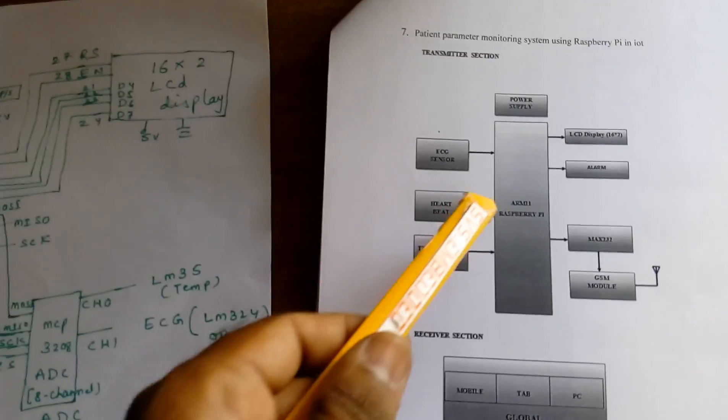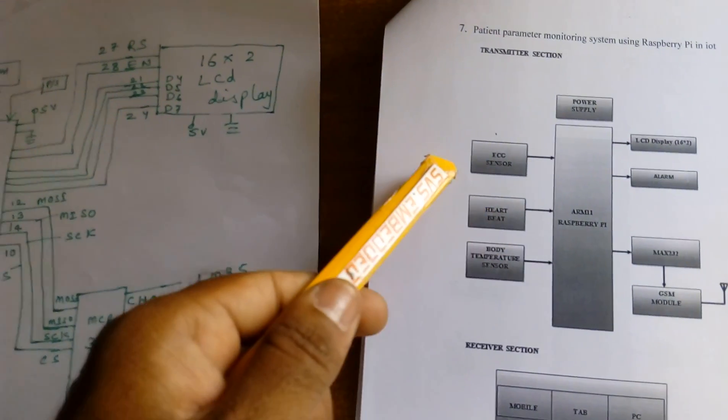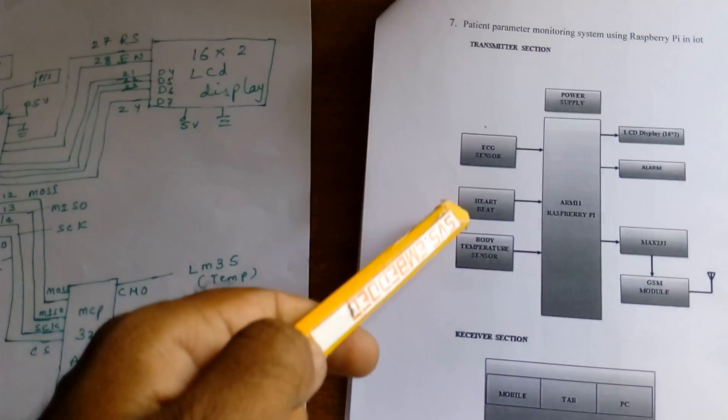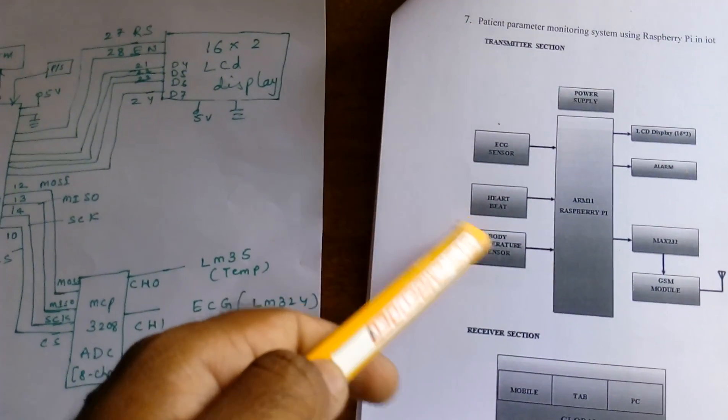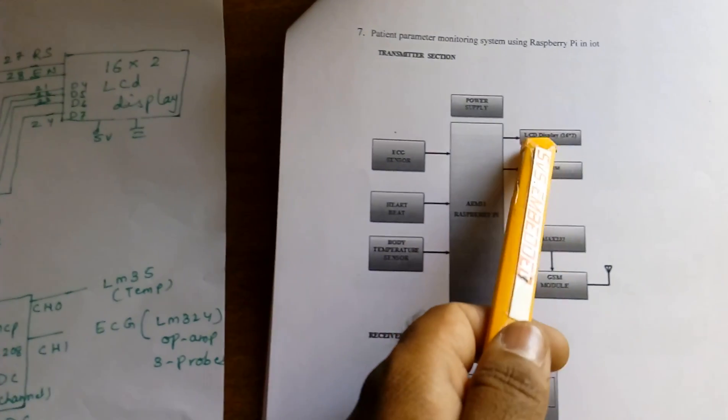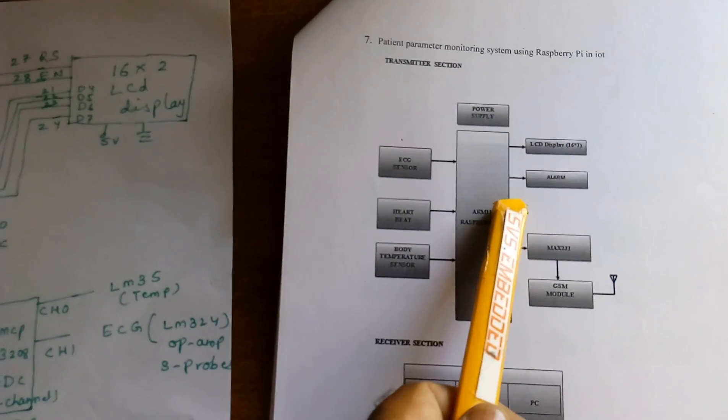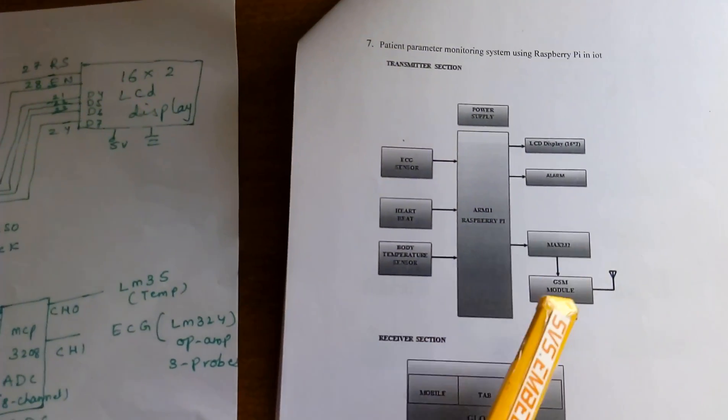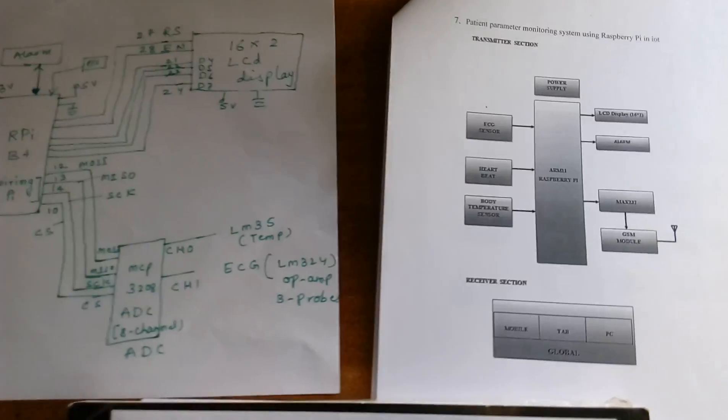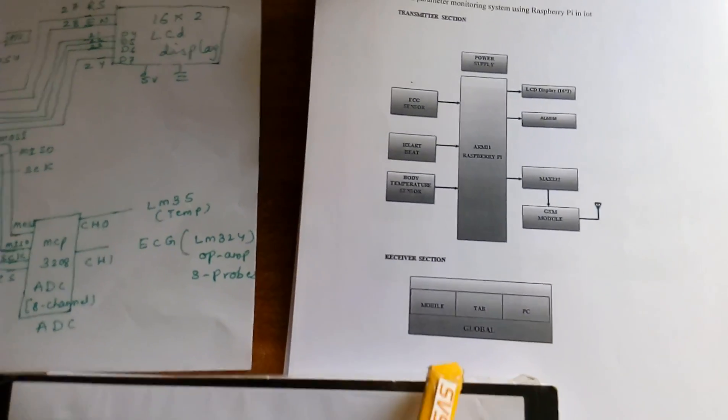In this project we are using a Raspberry Pi, ECG, heartbeat, and body temperature sensors that should be displayed on the LCD with one alarm and one GPRS modem SIM 900A, and that should be displayed on the PC.